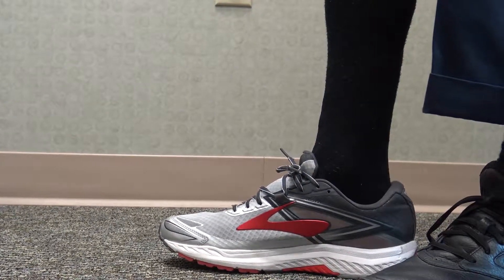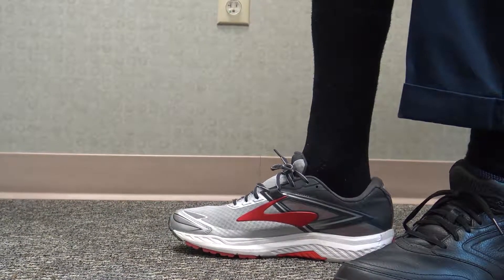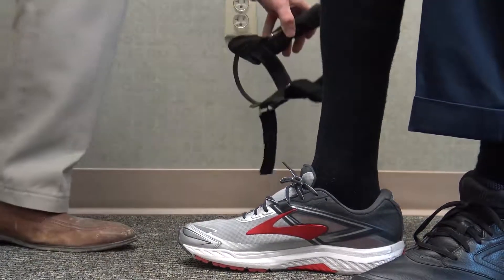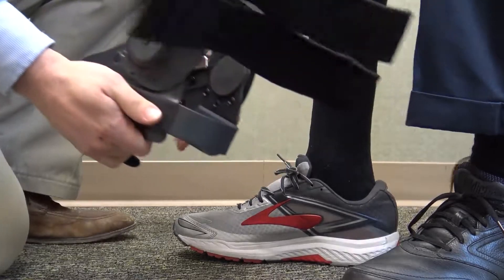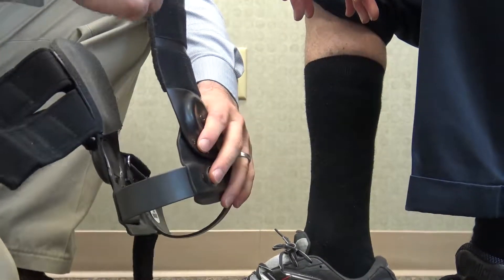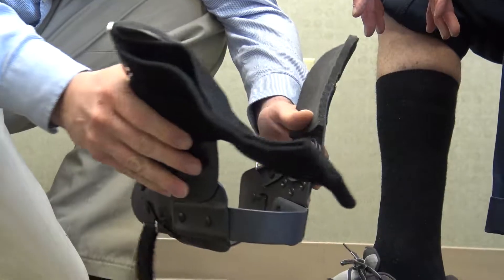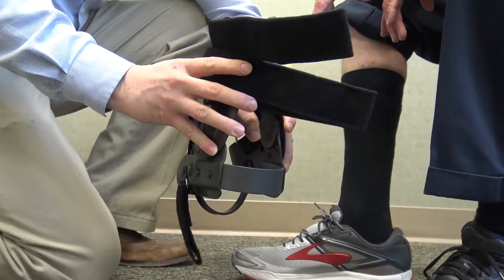Chris has got the brace in his hand. First thing he does is just take all the straps and take them off the other side of the upright. That way when you put it on, you can open up the wings as wide as you need them to be, and that way it's not pinching their leg.